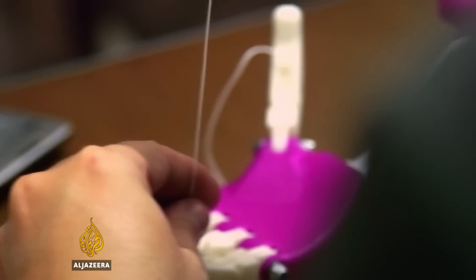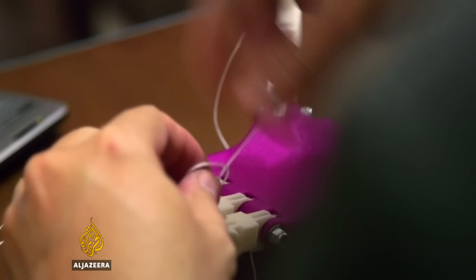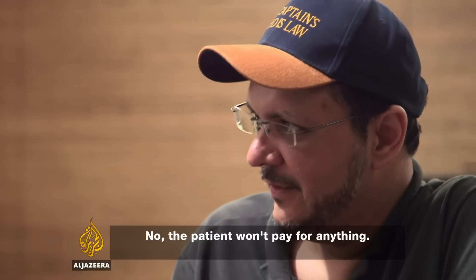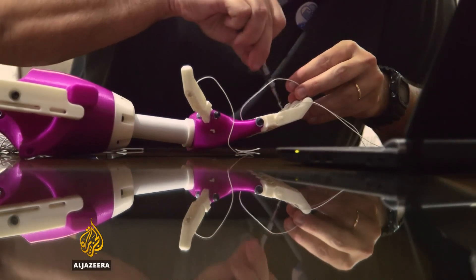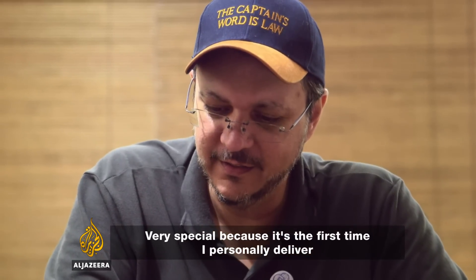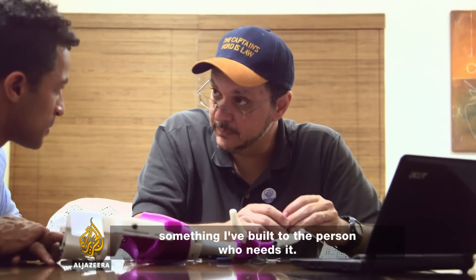Modern prosthetic limbs are prohibitively expensive for most people across the world, but Enable hopes to make their hands accessible to all who need them. It's free for the patient — they don't pay any money. It's part of the principle of the voluntary Enable. Tomorrow will be a very special day — it's the first time I'm going to take something that I built to a person who needs it.